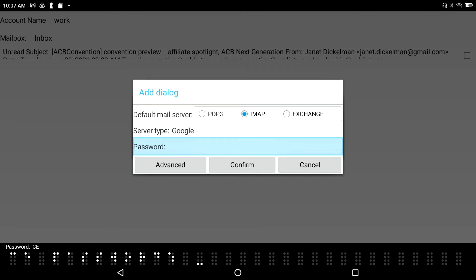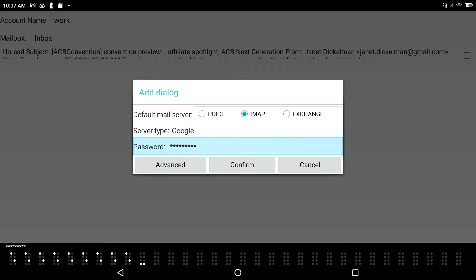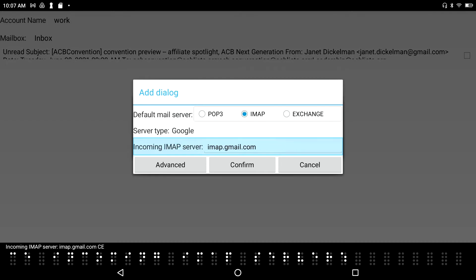After entering my password, I tab to the Incoming IMAP Server field, which is already auto-populated with 'imap.gmail.com'. I leave that as-is. The Outgoing SMTP Server is similarly pre-filled with 'smtp.gmail.com', so I leave that alone too.